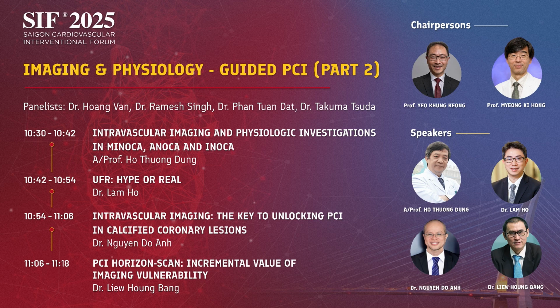Nowadays, they think the degree of reliability is, first, invasive FFR, second MuFR, third iFR. Of course, all this is still controversial, but what we are sure of is that in the ESC guideline it is class 1B. Yeah, that's enough, because for any medico-legal issue, just show the ESC guideline.